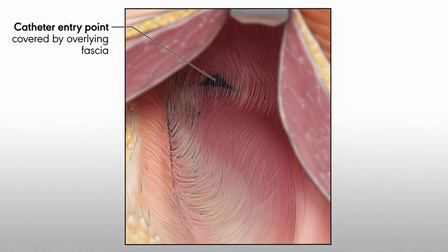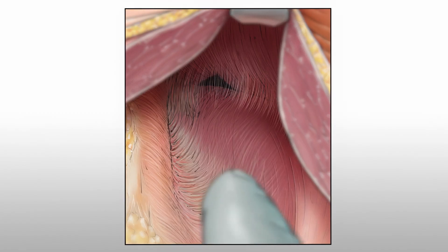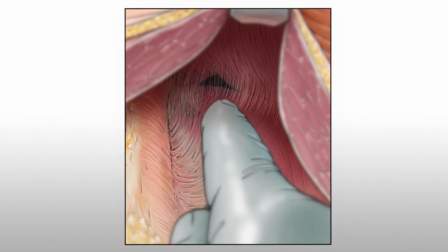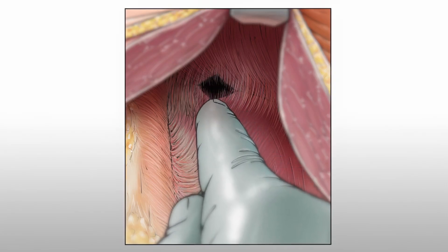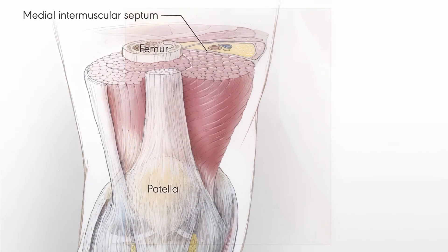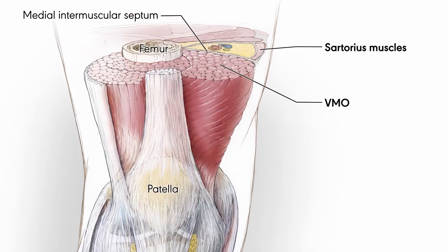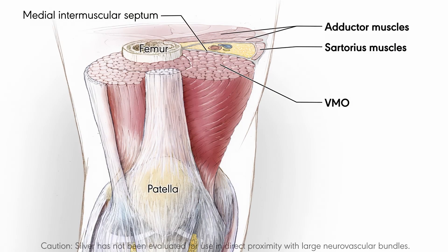The catheter entry point is covered by thin layers of overlying fascia, which should be bluntly dissected digitally prior to catheter insertion. The VMO, the sartorius, and the adductor muscles form the muscular borders of the adductor canal.